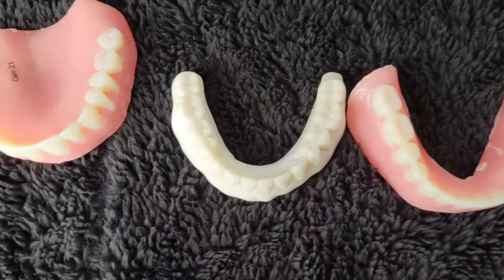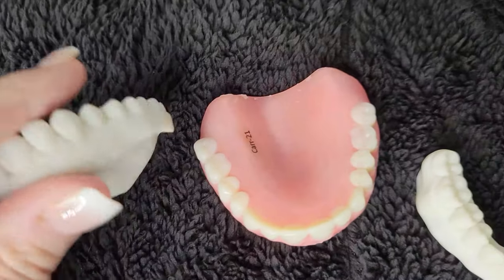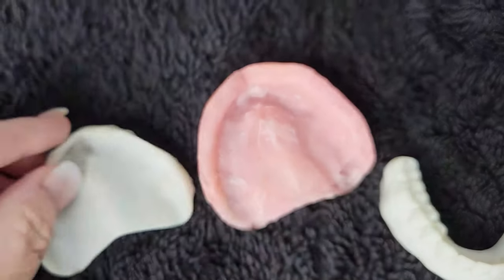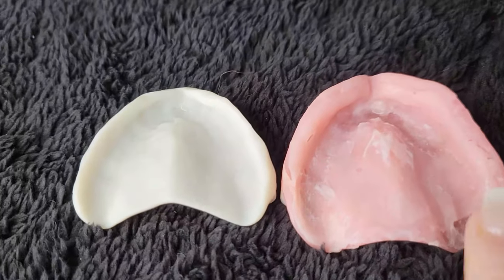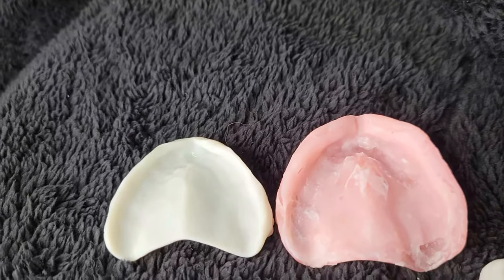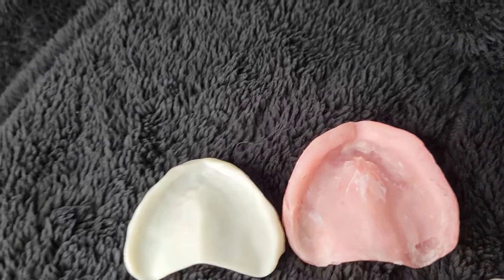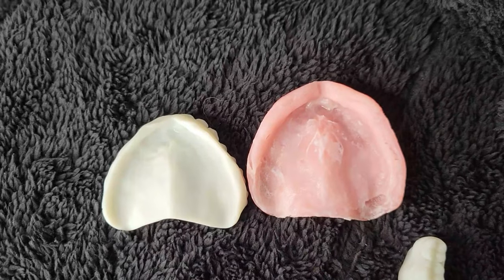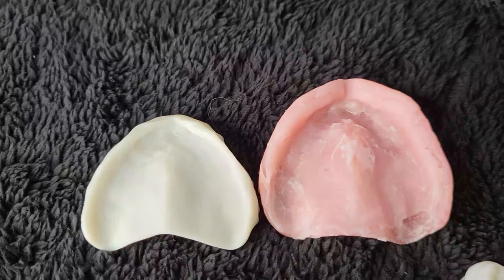They're much more comfortable than these dentures. I have a soft reline in mine right now. I tried to pick it out for a video I was doing. Look at that. These are really comfortable.